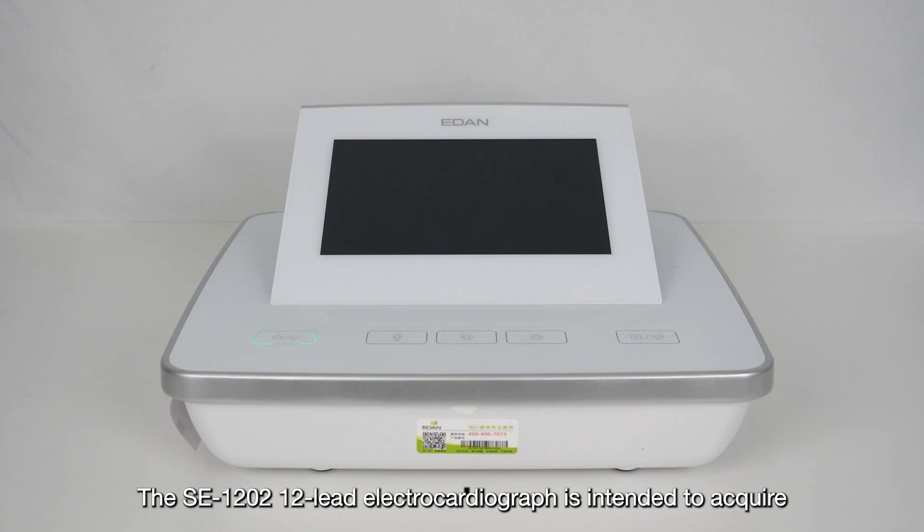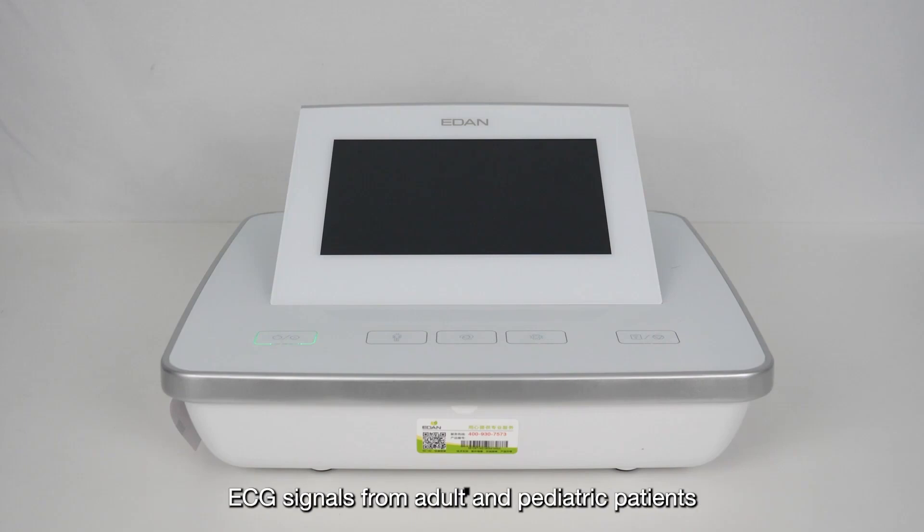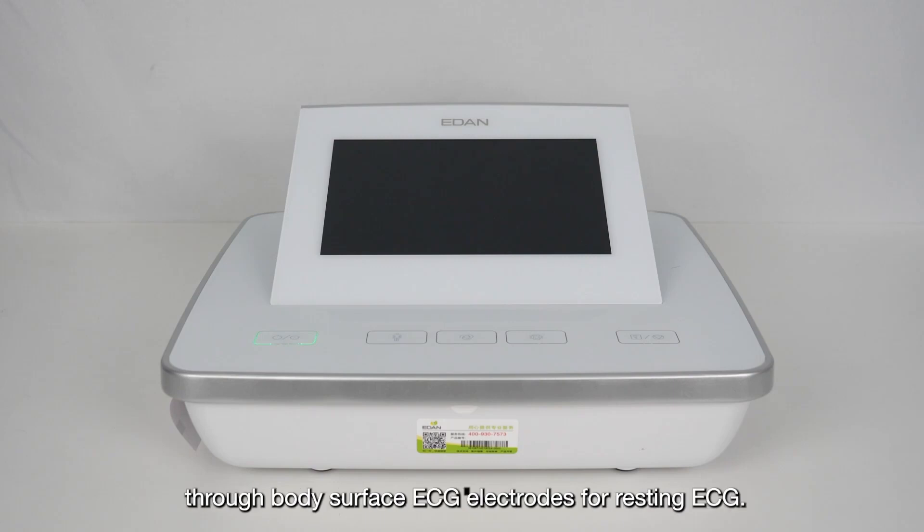The SE-1202 12-lead electrocardiograph is intended to acquire ECG signals from adult and pediatric patients through body surface ECG electrodes for resting ECG.